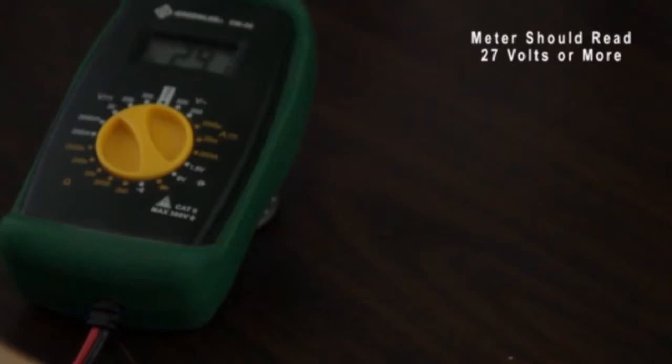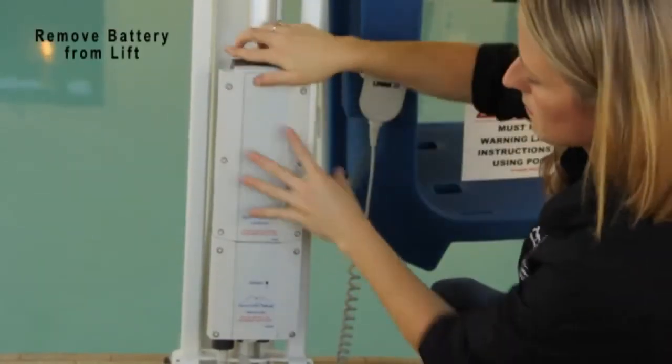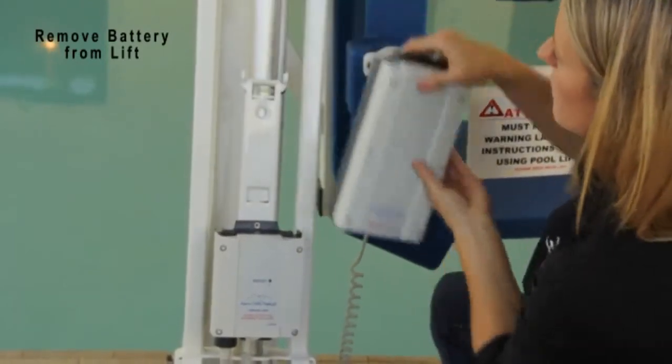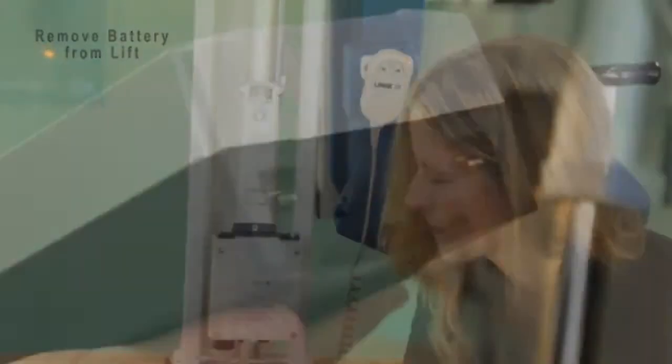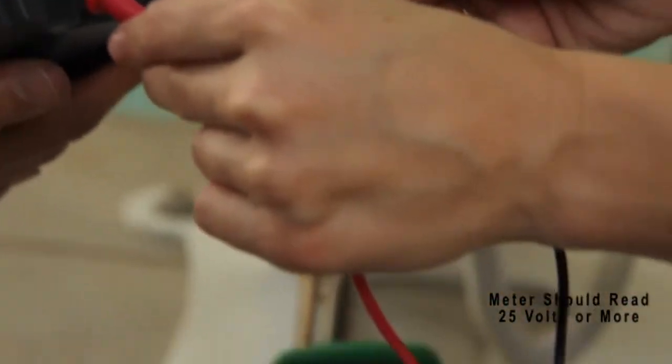If your charger has proper voltage and your lift still doesn't work, you will need to check the battery voltage. Remove the battery from your lift. Using a voltmeter or a multimeter, place the prongs on the two battery terminal tabs. A fully charged battery should read 25 volts or more.